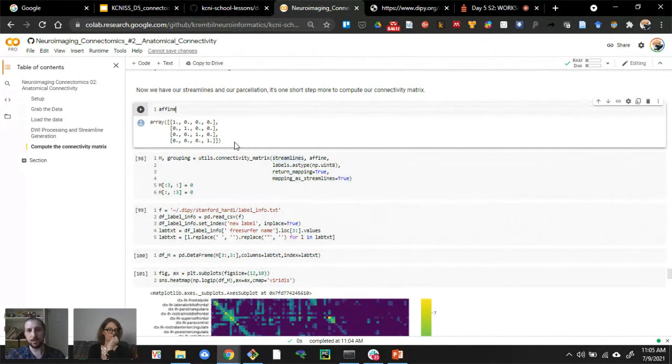We have this coordinate frame that we typically use where 0 is the middle of the anterior commissure. So you need to map this notion of a 3-dimensional coordinate system onto this abstract block of numbers. That's what your affine is doing.